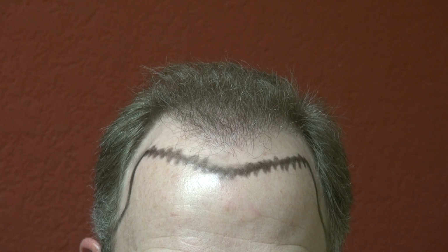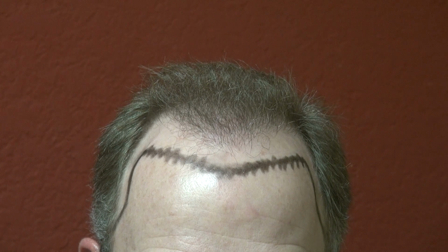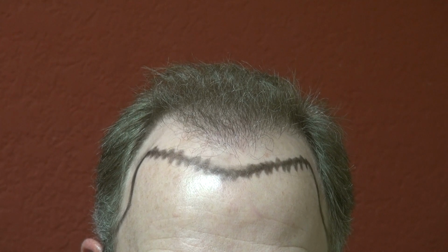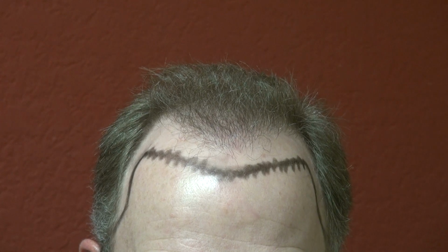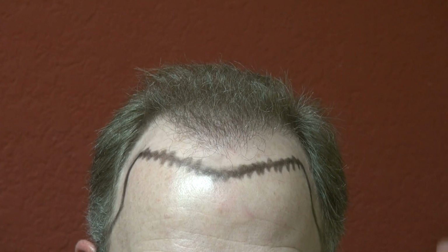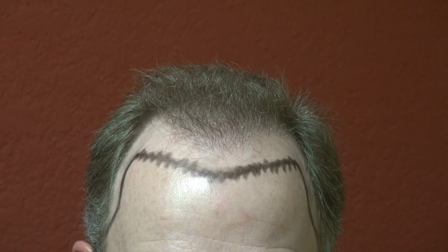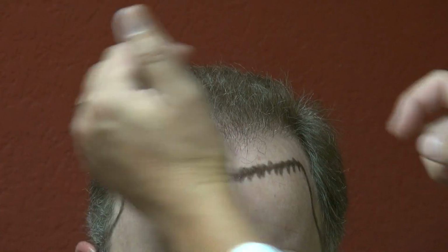But as you know, hair transplant is not just the surgical skill involved. It requires a lot of artistic and aesthetic detail to ensure a very natural result. In general, creating the hairline is meticulous detail, and on average, for Caucasians, from the mid-eyebrow to the mid-hairline is around 7.5 to 8.5 centimeters. This client is actually around 7.5 centimeters. Exactly, we did the measurement.